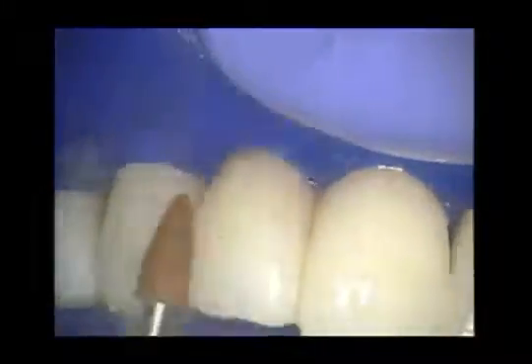Now that brings us to the next thing. One of the biggest problems with composite finishing is that we have too much heat generated. So I get these teeth very wet with the brownie, with the pumice, no matter what. You'll notice that if you don't use moisture, the composite will have a matte finish, and that's because you're baking the composite. Once you've overheated it, it gets chalky, and the more you polish it, the chalkier it gets. So I use lots of water. Now the other thing is, it'll also heat up the pulp. So there's a lot of reasons why we don't want to overheat the teeth.